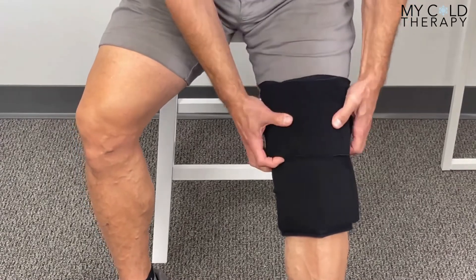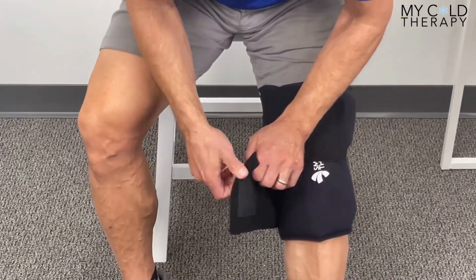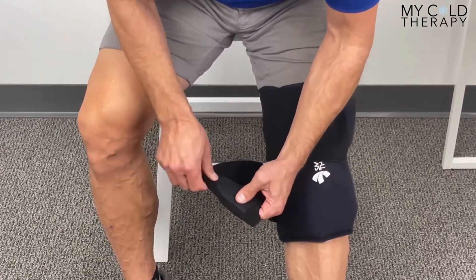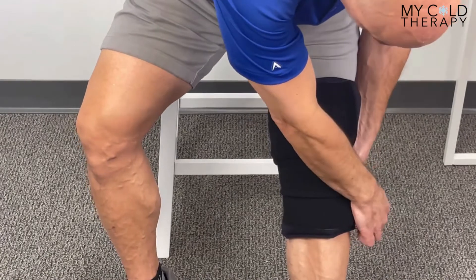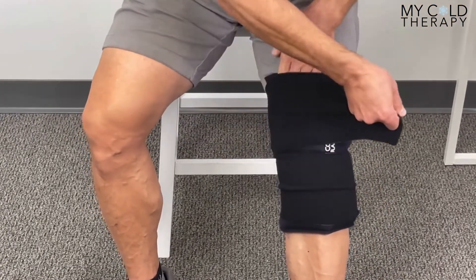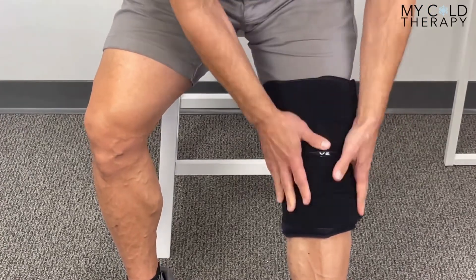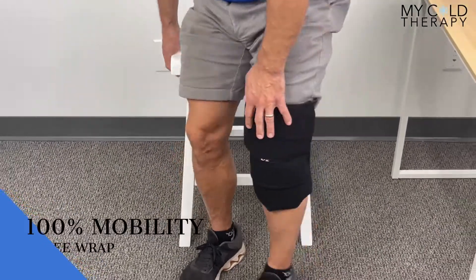Once you get the wrap where you want it, take the compression straps and really tighten this down. This is going to do two things for you: it's going to get the cold into the joint, and it's also going to allow you to be a hundred percent mobile, as I will demonstrate.